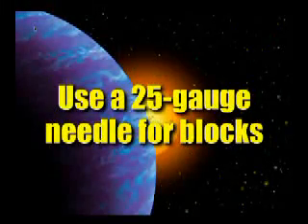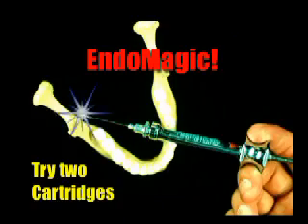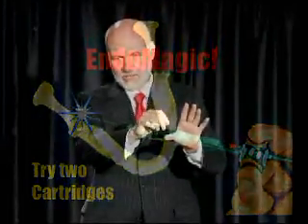The other thing — and we mentioned this — is you could use two cartridges of anesthetic: one cartridge without epinephrine and one cartridge with epinephrine. Here's the technique: take a little topical and wipe it on the tissue in the area you're going to inject. Now we all know that topical does not work. Most of us will not even leave it five or six seconds before we go in for the injection. So the topical does nothing — it's a nice distraction.